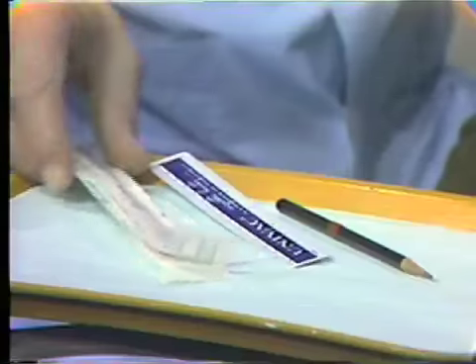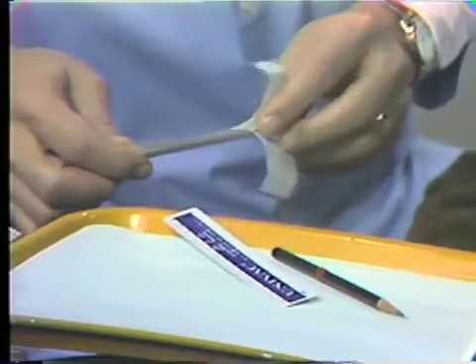Our next step is the determination of the vertical dimension of occlusion. Inasmuch as this is a bit of a subjective determination, we utilize any and all things which will be of aid to us. One of the very important things is the patient, if he is wearing dentures, as Mr. Monahan is here. So the first thing we will do before any other measurements are made is we will determine the vertical dimension of occlusion with the dentures he is now wearing. We will accomplish this with the use of the tongue blade and the millimeter rule.